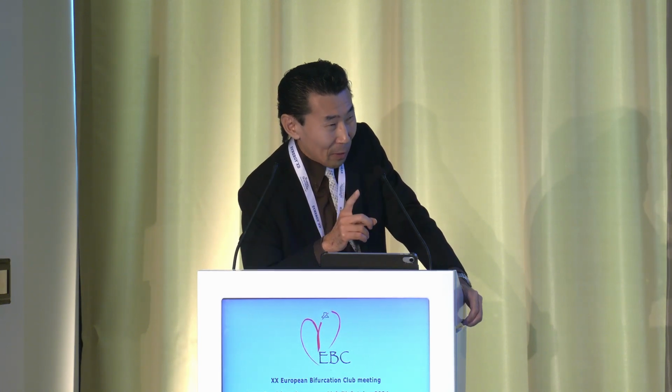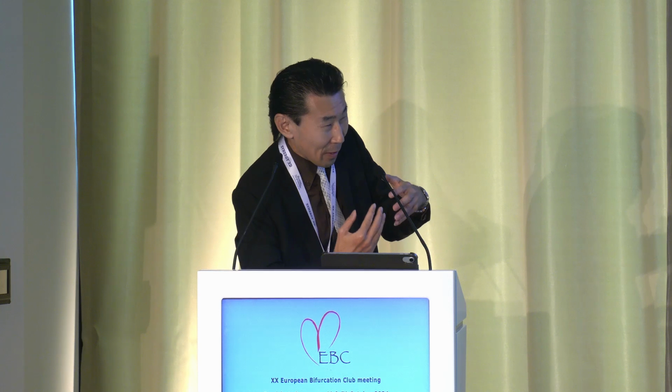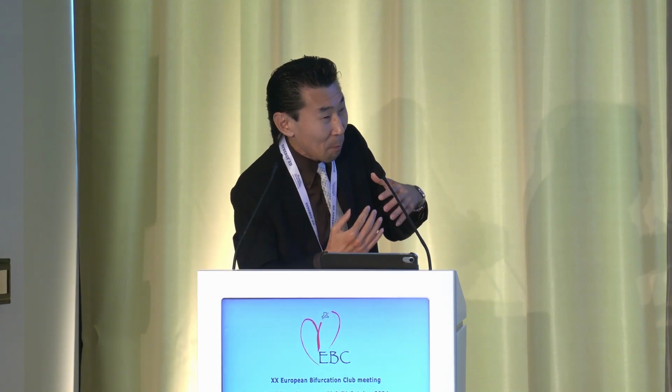Another point is that it is so difficult to identify the difference in the guide wire bias, so maybe it is a limitation of this software now. But it's something to think about, because I think the wire bias of, say, a rotastiff wire, which is what you're looking at for whether rotor ablation is going to be effective, will be very different from a floppy coronary wire.